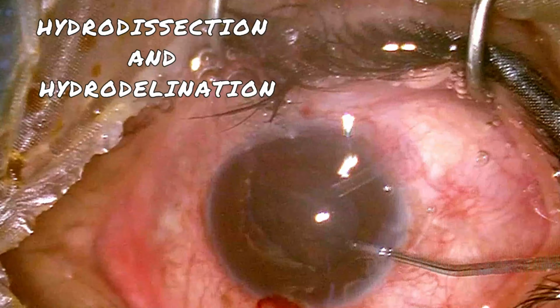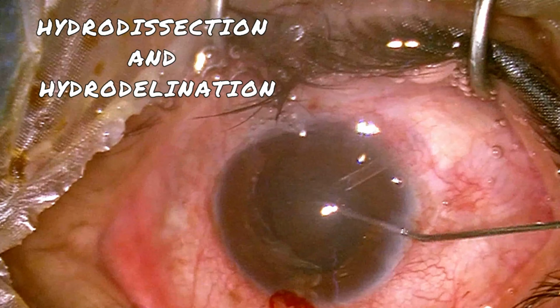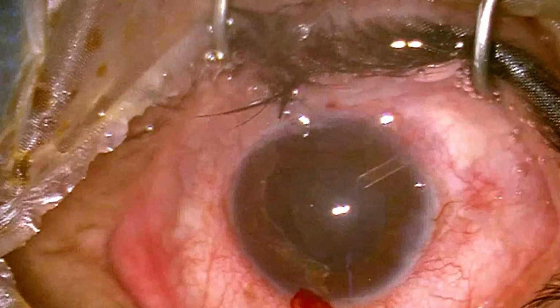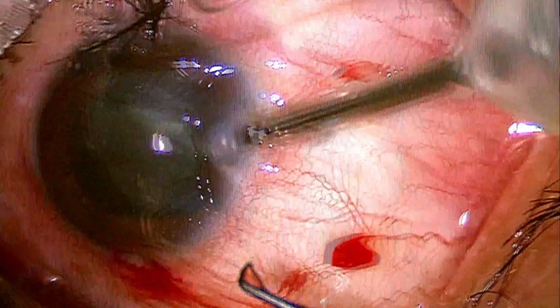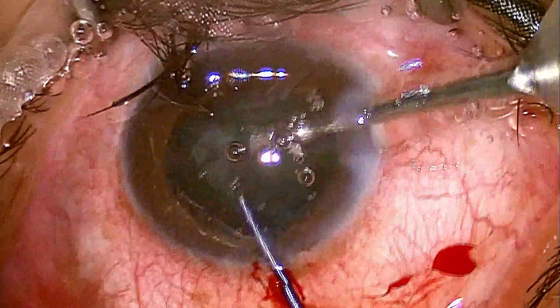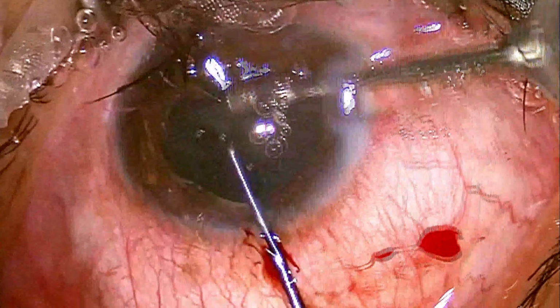Also, while doing the phacoemulsification, we should keep in mind that the phaco probe should be opposite or away from the Ahmed glaucoma valve irrigation tube, as the nucleus pieces may obstruct the passage of the valve. For routine phacoemulsification, a blunt chopper through the side port and a 2 mm phaco probe of the Alcon Infiniti phaco is inserted through the main port.